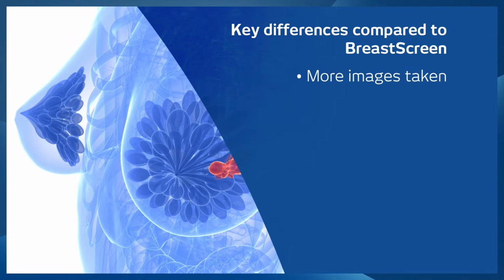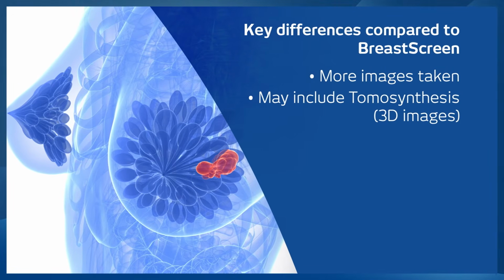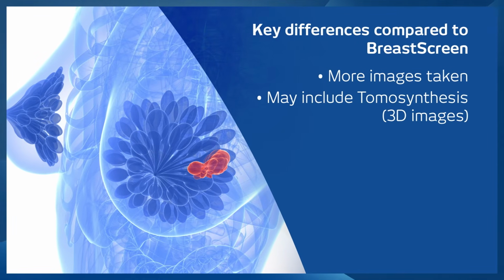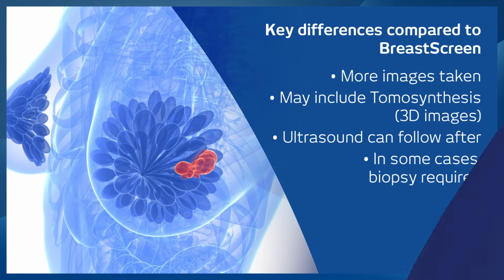more thorough investigation. Most commonly, we would use tomosynthesis mammography as opposed to BreastScreen using conventional mammography at their initial appointments. And also diagnostic mammograms are taken in conjunction with ultrasound, and sometimes we may even progress to a same-day biopsy if the results are concerning.